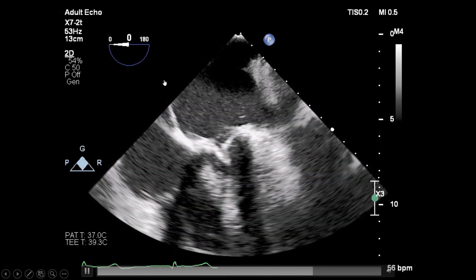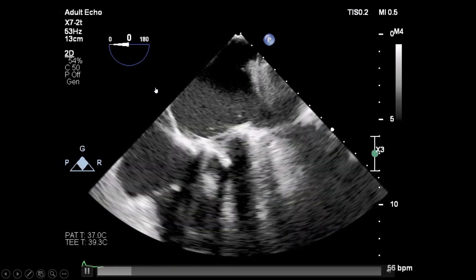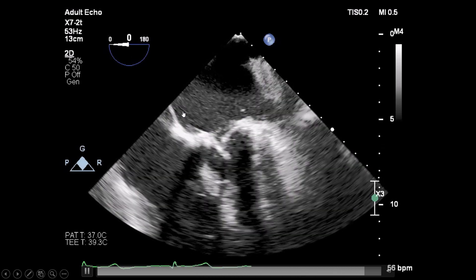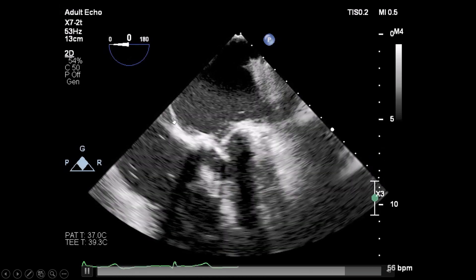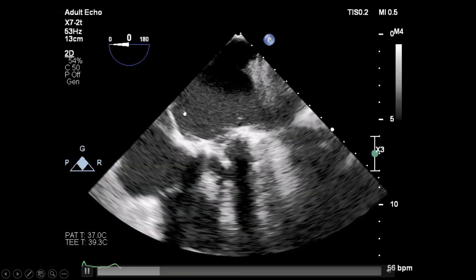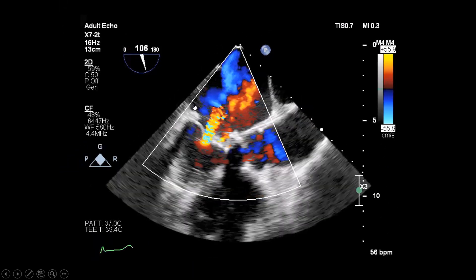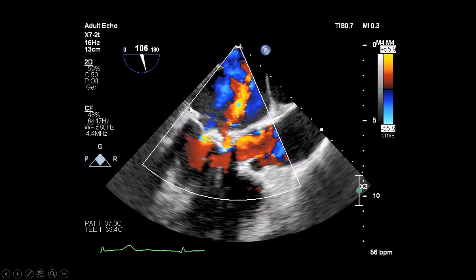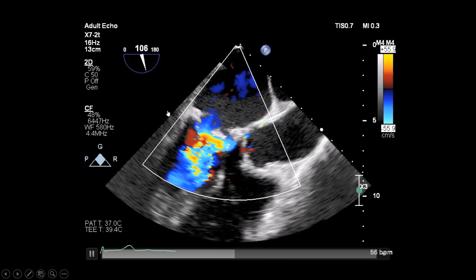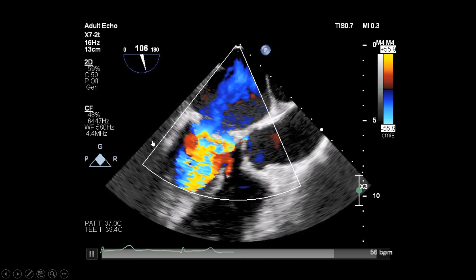Starting from the mid-esophageal view, you can appreciate how big the left atrium is. This is the mitral bioprosthesis, and from here you can see the leaflets are very stiff and restricted in motion. In this long axis view, the leaflets hardly open, which is why you can see significant aliasing.